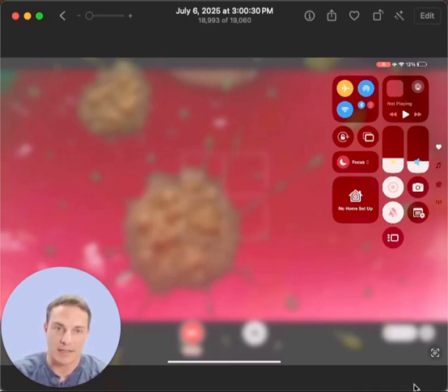So we have some exciting things in the future about this with folks, to make that something that is bespoke to their mannequin itself, to make this more high fidelity. But I wanted to share this with you guys. I'm very excited about where we're moving with this.